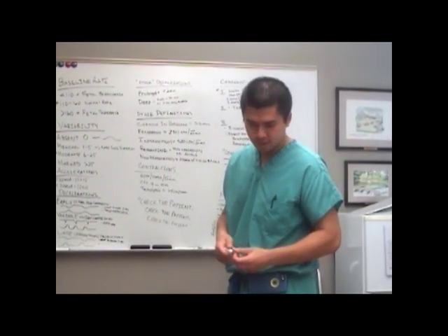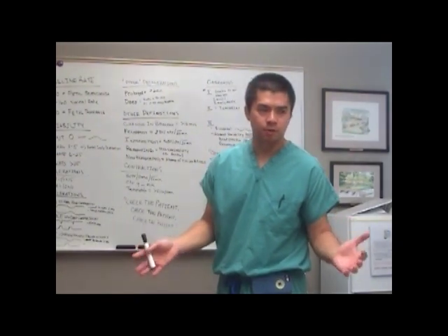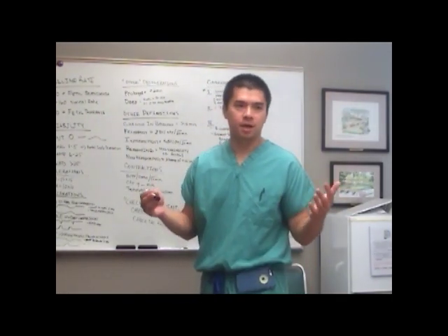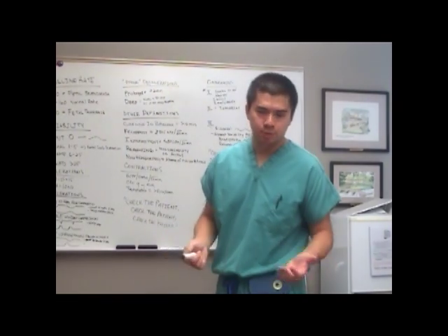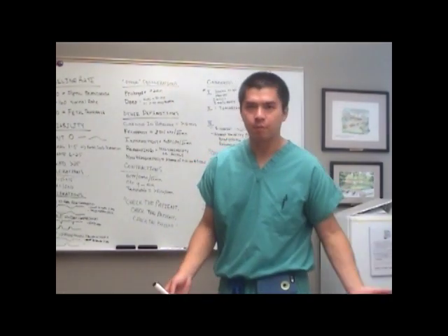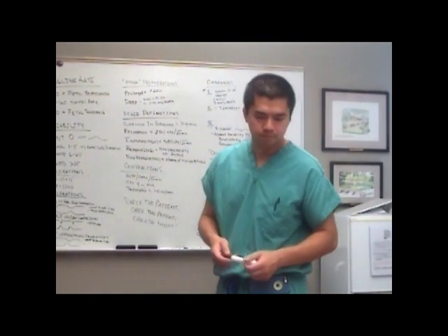And so I would take it in context of your overall fetal heart tracing. If it's overall reassuring, you've got moderate variability and accelerations in a mom who's been otherwise healthy, it's probably not a big deal. But if you had a mom that's had recurrent variables, or you've had a run of lates throughout the labor process, then it's probably a little bit more concerning. But again, you're taking it in the context of the overall picture of the fetal heart tracing and the other aspects of it, rather than just that isolated decel coming off of a shoulder.